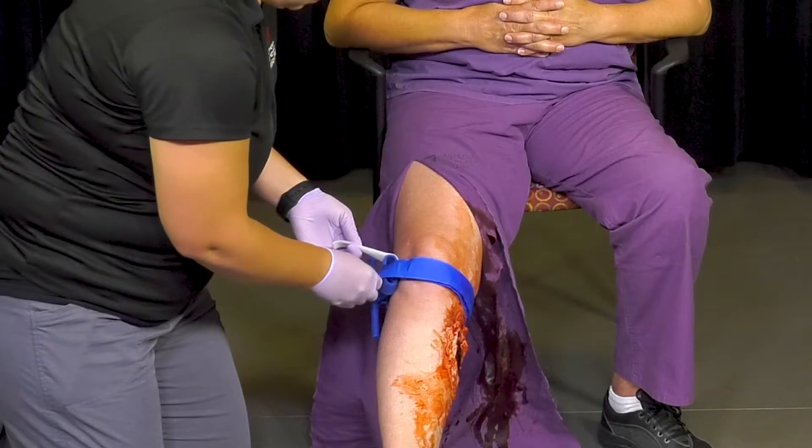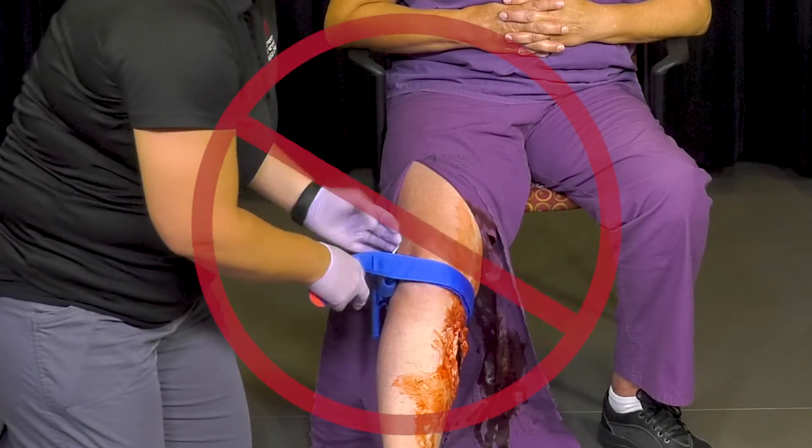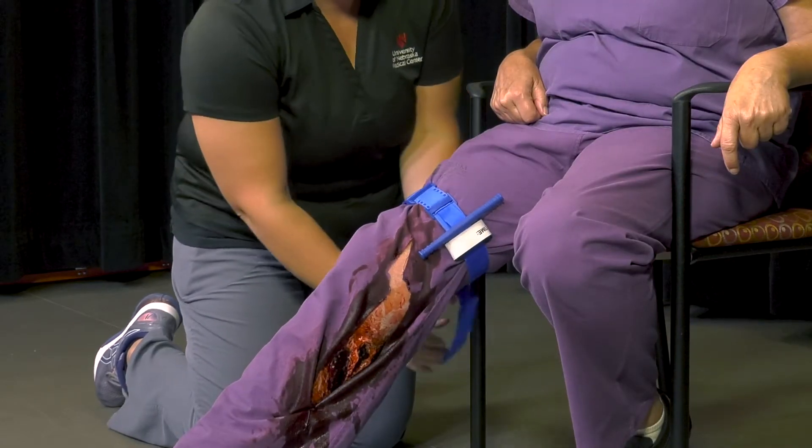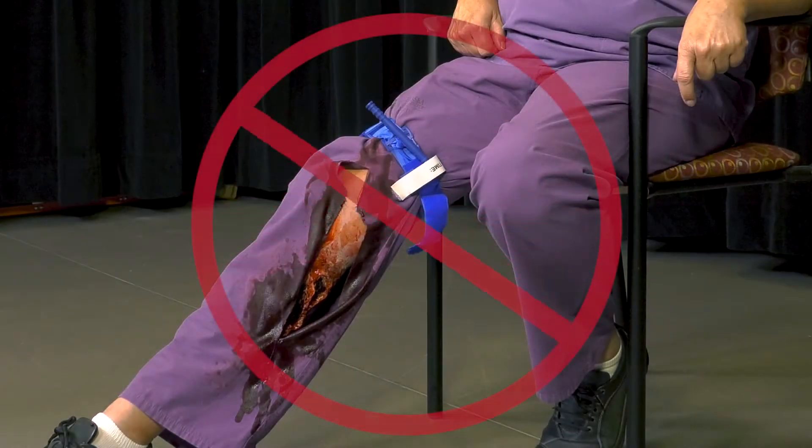After the wound is exposed, assess where to place the tourniquet. There are a few things to consider in regards to placement: never place the tourniquet over a joint, and apply the tourniquet directly on the skin, never over clothing.